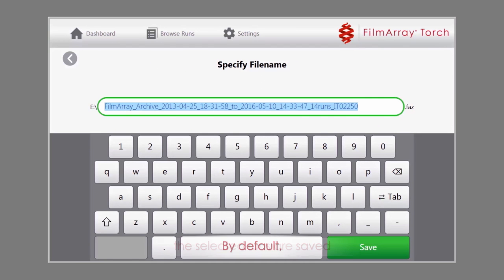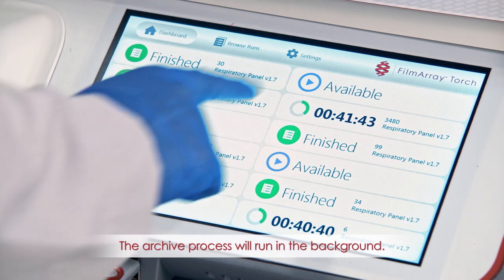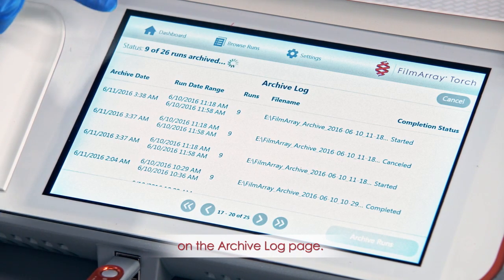By default, the selected runs are saved to a file with the extension .faz, with the first and last dates for the set of runs being archived. The archive process will run in the background. The status of the archive can be seen on the Archive Log page.